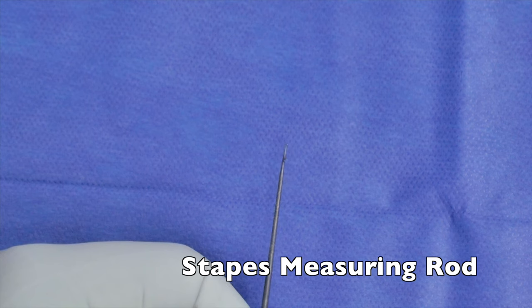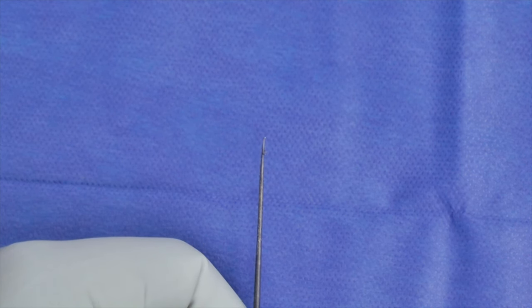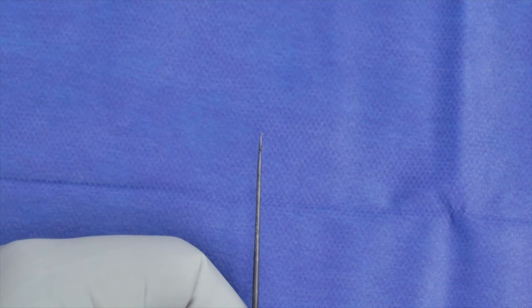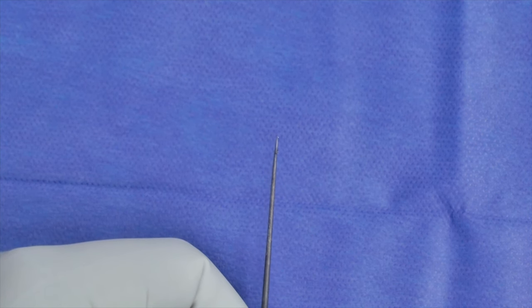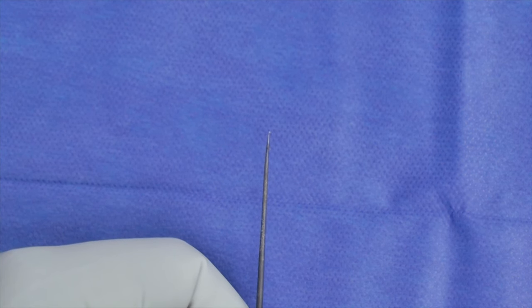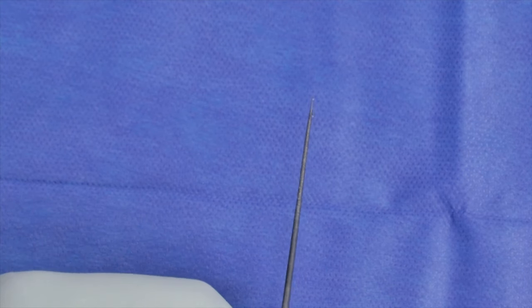This is our stapes measuring rod, commonly used for measuring during stapedotomy. You'll use this to measure the distance from your long process of your incus down to your footplate to determine what piston you're going to use. I actually almost always just use a 4.5mm without measuring, but if you do want to measure, this could be used — particularly if you're anticipating a malformed incus or something else like that.